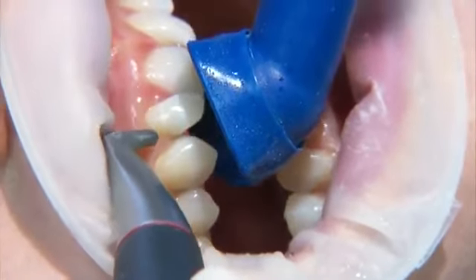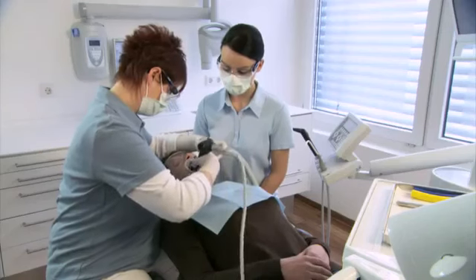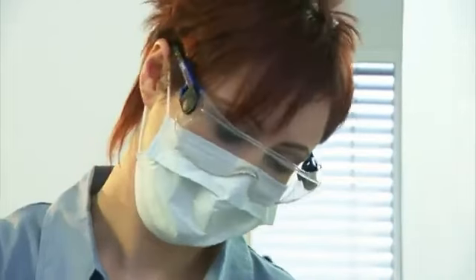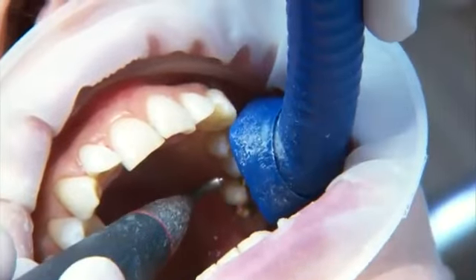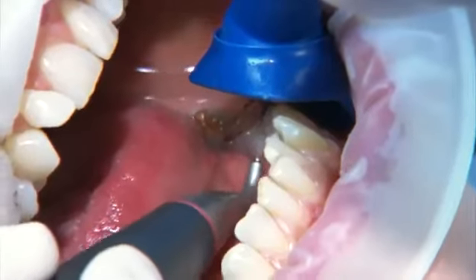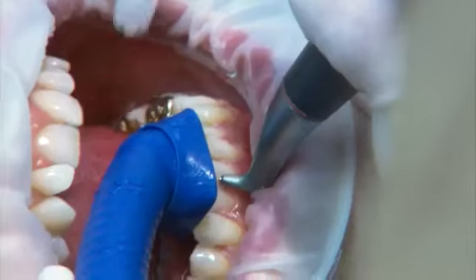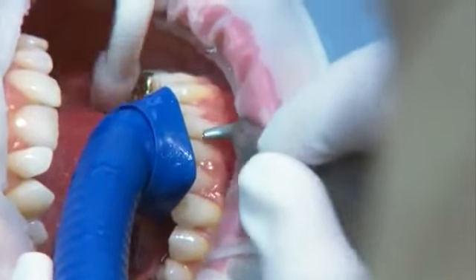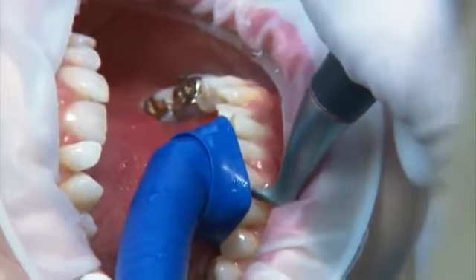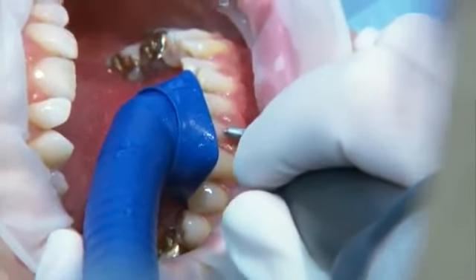The uniquely adjustable prophylaxis cannula optimizes aerosol evacuation with spray powder in buccal and palatal applications. Effective suction significantly reduces the dispersion of aerosol with spray powder in the treatment room. Surface disinfection and cleaning are made easier. Oral mucosa is optimally protected by the shield, and irritations of the oral mucosa from the spray powder are significantly reduced.